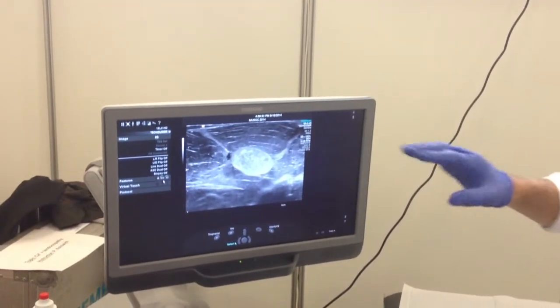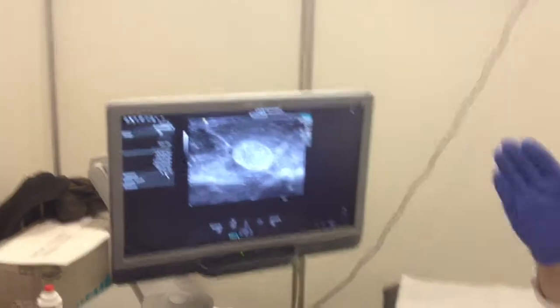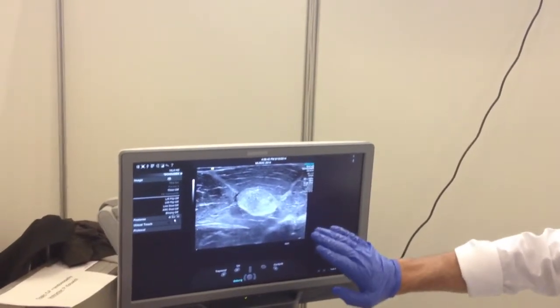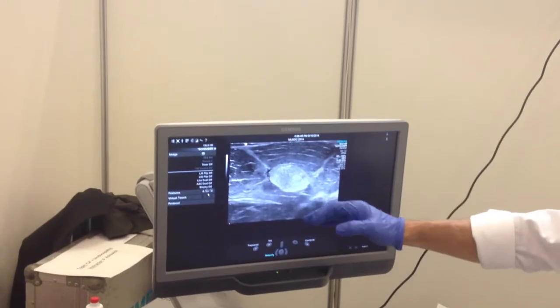Sometimes in the delta, as you go, you will see a big tendinous portion. They are painful, so if you can try to avoid them, that's better. You can see the muscle. Try to avoid the tendinous portion of the delta.